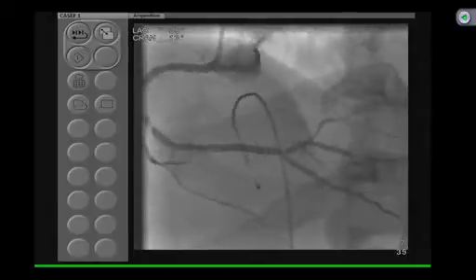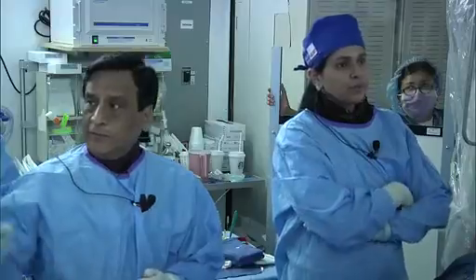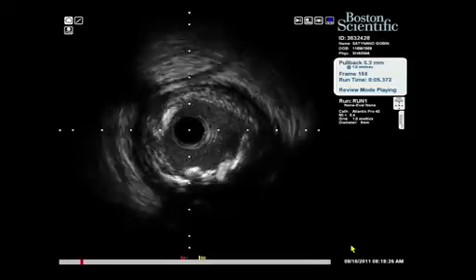Okay. Now you want to quickly run the IVUS. We are done in this. Yeah. Let's show the IVUS. We can screen to the IVUS, please. Oh, they have it. Okay. So if they can show it from the good.